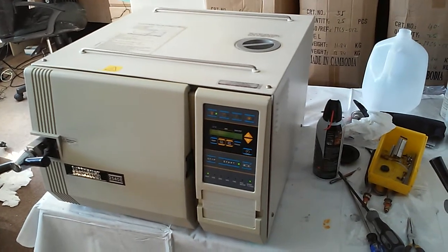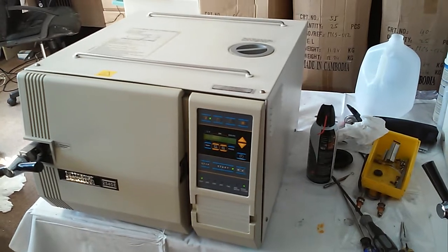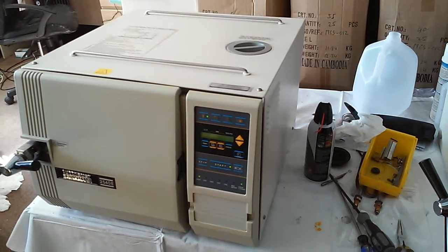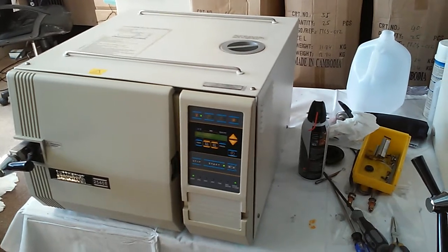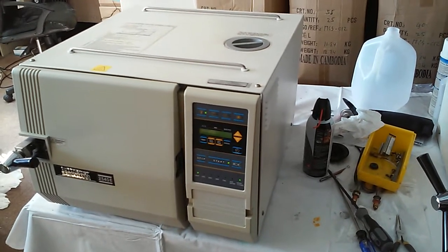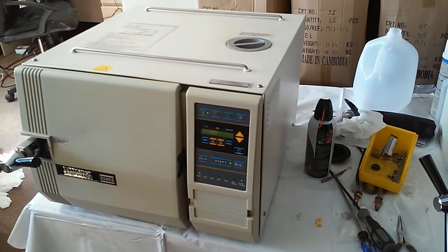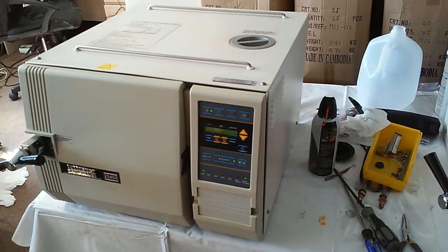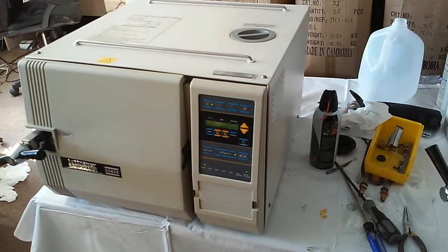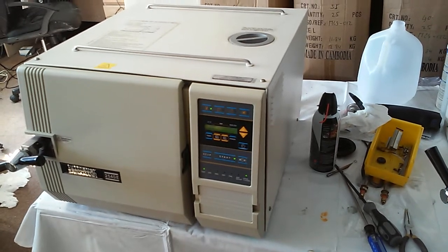Inside the machine, there are two most important electric boards. One is the AD convert board — analog-to-digital signal. Another is the digital board, which is like a CPU. It has EPROM and a battery on the digital board. The digital board normally comes together with a display board, but if you want, you can buy it separately. Usually they come together with the front display board.